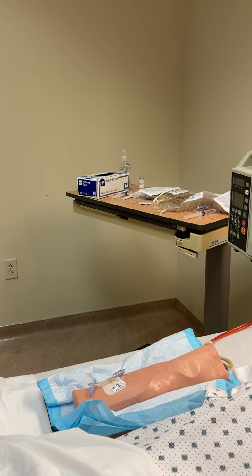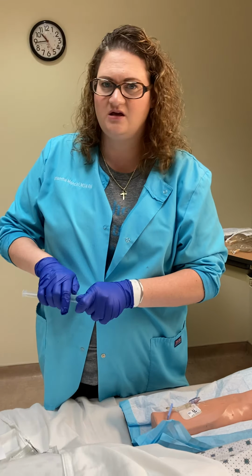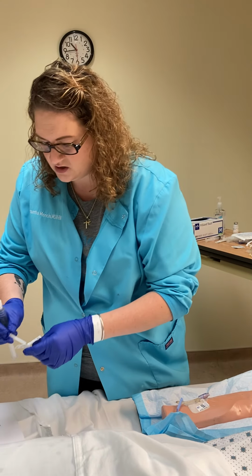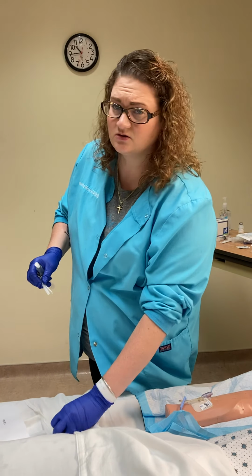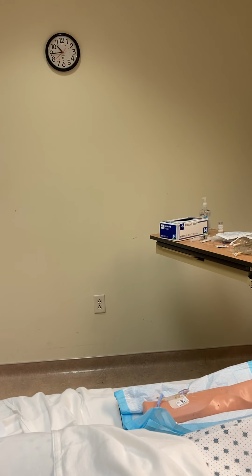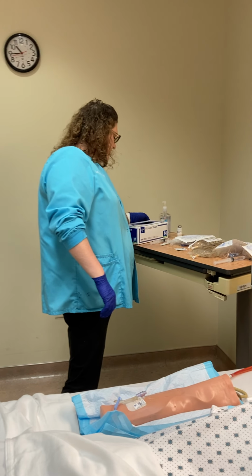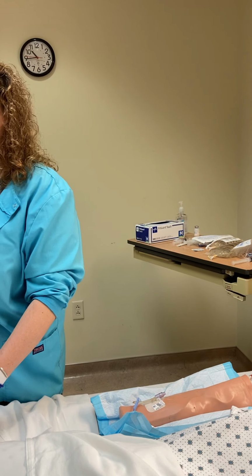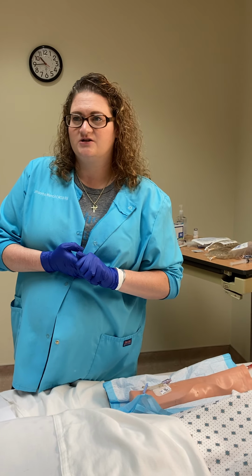You'll see both. Your totes usually have the simple connectors, but you may have the luer lock in them. In the clinical setting, you'll see more than likely the luer lock, but some facilities still use the simple connector. So you'll see both out there. Okay, so we got through that. We went through assessment. We just went through our types of connectors.